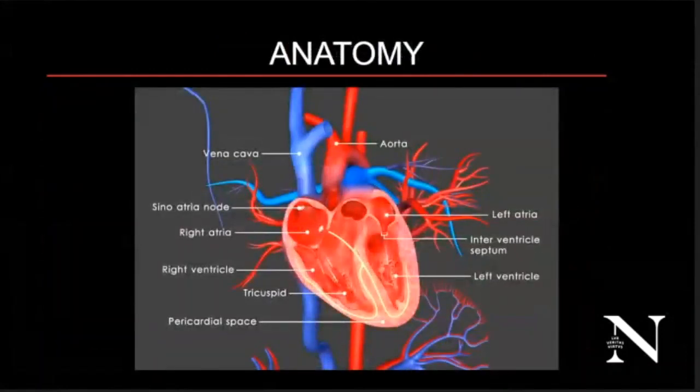So, a little reminder about the anatomy. Again, ultrasound is going to let you look right at the heart, and I want everyone to start by learning the walls of the heart. That's the easiest place to start. Start by getting a good view. We're going to talk in a second about the parasternal long axis view, and then you learn how to measure wall thicknesses. That's going to be step one.